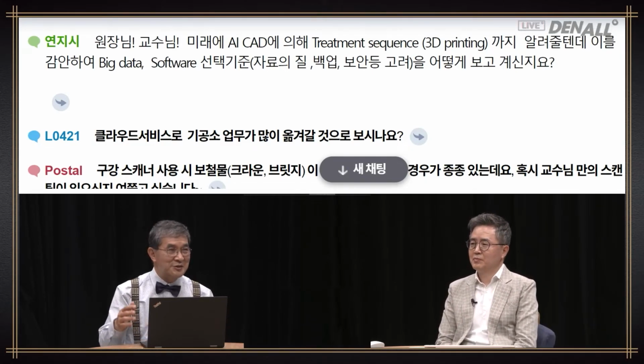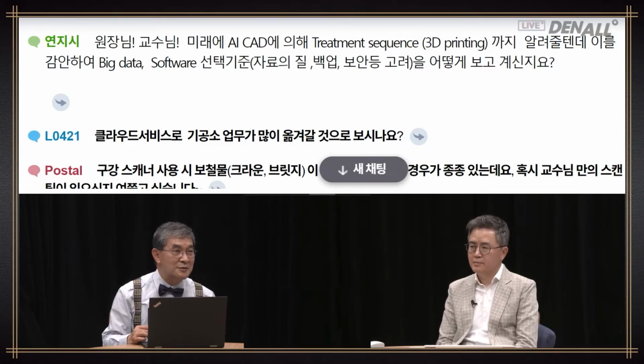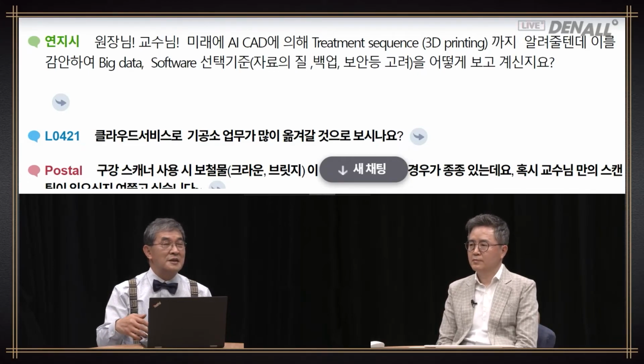In developing a digital denture called One Denture, currently, we need to put in training. We need to take impression and do scanning. If we are to use an oral scanner for denture, we need to determine how to set the denture margin. This is a difficult question. This will be overcome one day, but it's going to be time-consuming.